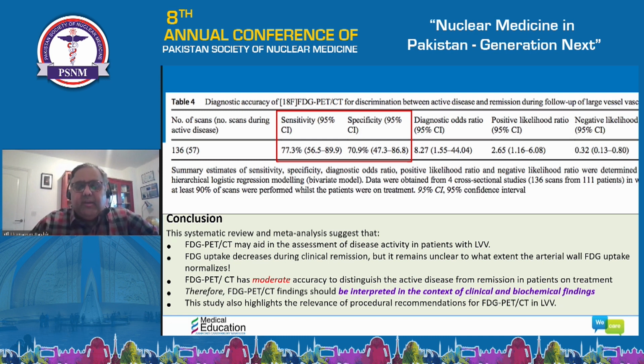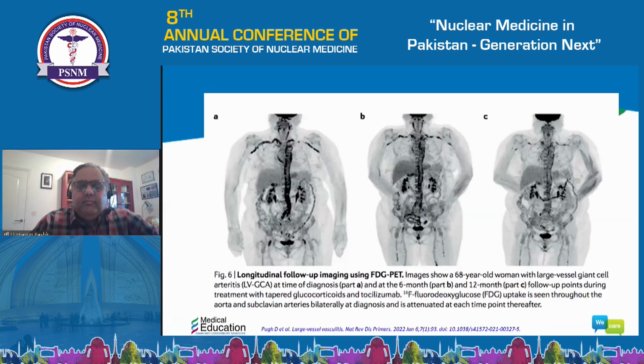If the patient is fine, biochemical markers are settling towards normalization, the scan findings will be residual or reactive. If the patient is clinically unwell, markers are up, and we have a scan which is still showing uptake, then of course that will be interpreted accordingly. That's very crucial. Again, collaboration with the clinicians. You want to have the history, why you are doing the scan, at what time you are doing the scan, what is the timeline of the treatment. It's not always easy to stop all sorts of treatment 6 weeks before to do a PET-CT scan with FDG. So, it's a complex situation. It's not that simple. And basically what comes into play here is experience. Next slide, please.